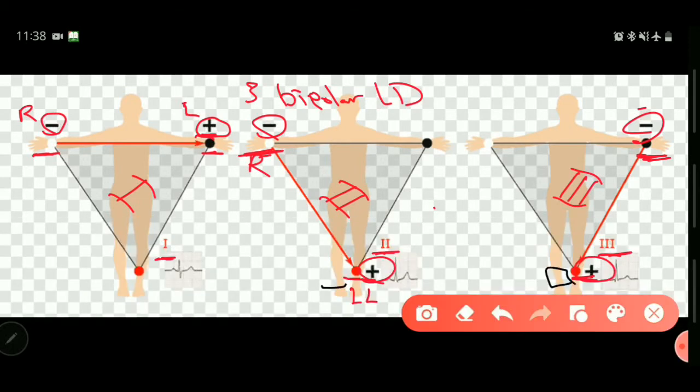People are going to ask, why didn't we talk about the right leg? Why did we always talk about the left leg, but not the right leg? The right leg, in our work here, is not important. But sometimes we put a lead on this leg so that the excess charges go out from the body through this leg. The excess charges that interfere with getting a good quality recording of the electricity of the heart go out from the body through this leg.